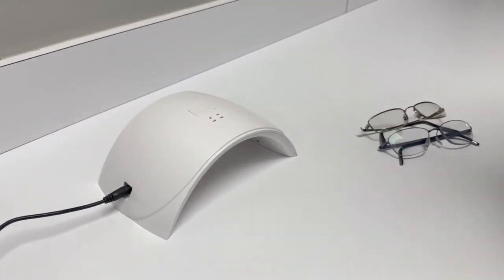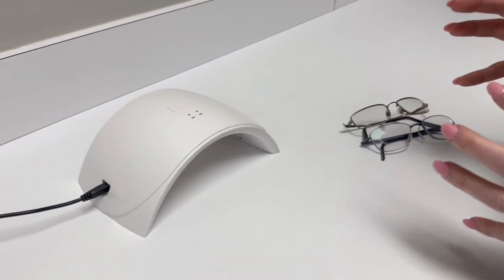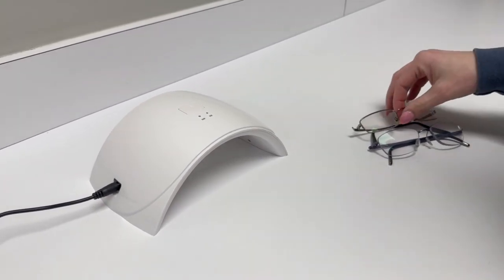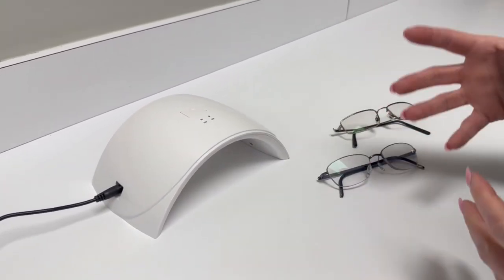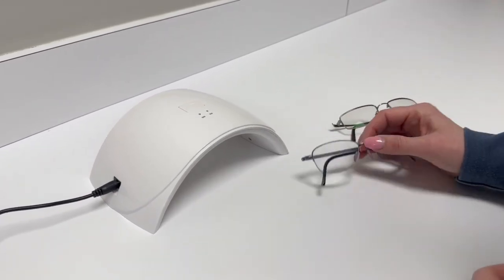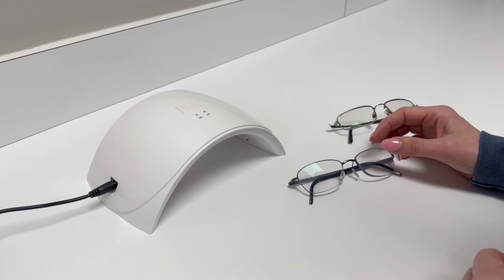Our photochromic tester is a pretty important device that every office should have. The reason for that is we've all had a pair of glasses come in, or a patient come in and say, 'Hey, are these transitions?' And we really don't have a way of testing that.